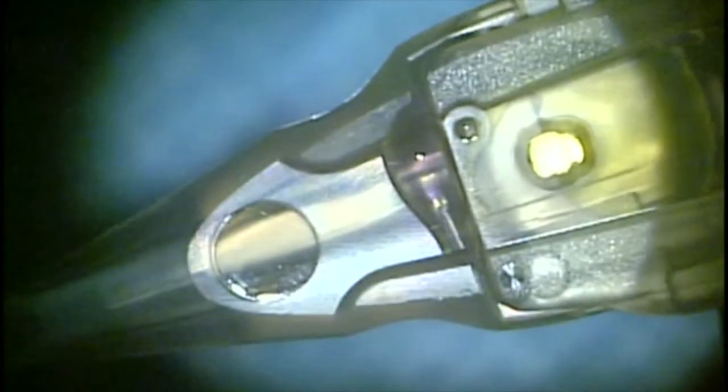And this is the final example we'll show. You can see here high up in the cartridge that that haptic is probably not going to catch on the side of the cartridge and fold into the proper configuration. So we're getting our second instrument into the tip of the cartridge there, positioning it such that it blocks the path of the leading haptic from continuing to progress in a straight manner.